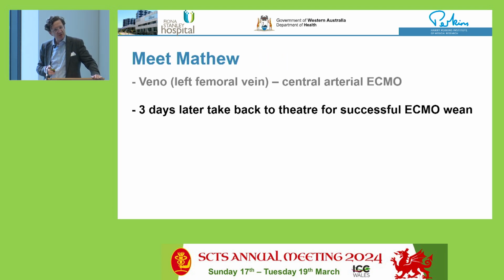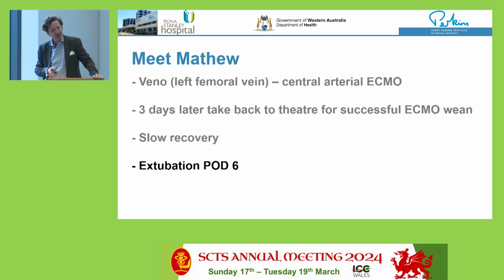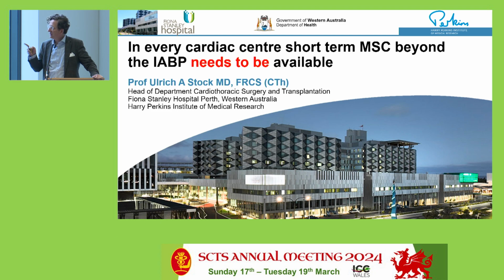So what we did with Matthew was, yes, weaned off. Was he a flyer? No. With a BMI of 45, we all know that it was a slow recovery. However, he was extubated at day 6, and 20 days later, he was discharged home. And while this is going to be very important, think about what we can achieve. So I would like to replace the "should" with "needs to be available." So this country and the patients and every cardiac surgeon in this country needs to have access to short-term mechanical support to save patients' lives.